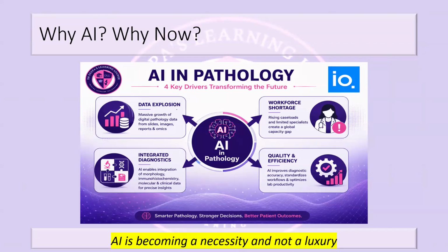Pathology today extends far beyond the H&E. It is not just the H&E slides that you're looking at. It used to be just H&E slides where you gave a provisional diagnosis, but now it's far ahead of that. We now routinely work beyond H&E. We look at the immunohistochemistry, we look at the digital whole slide image, we look at the multiplex immunofluorescence, we look at spatial transcriptomics, we look at proteomics, we look at molecular diagnostics, we look increasingly at a multitude of data sets.